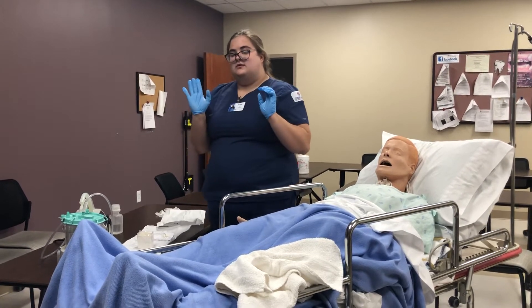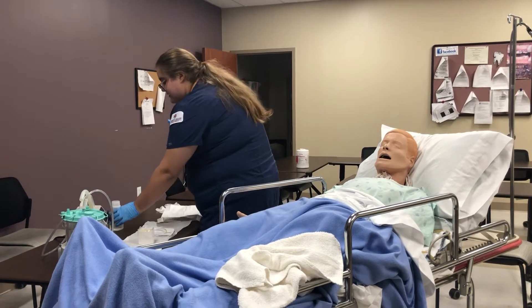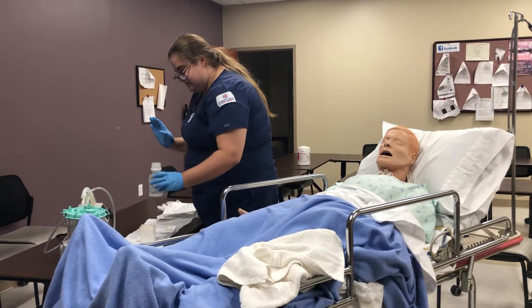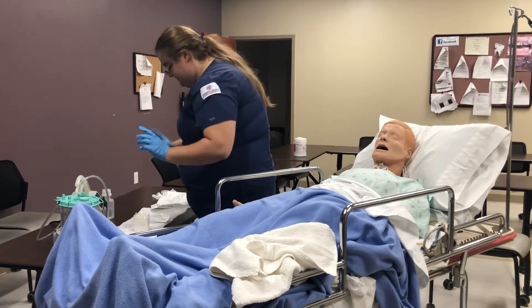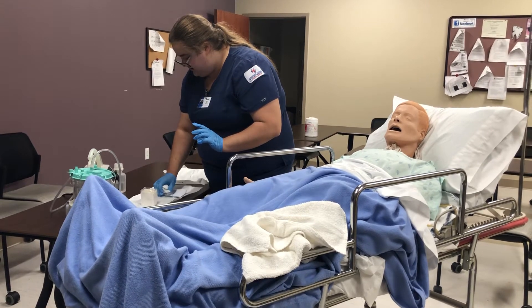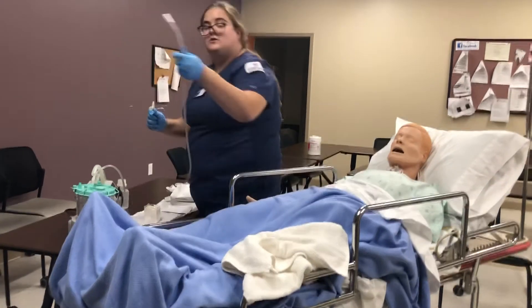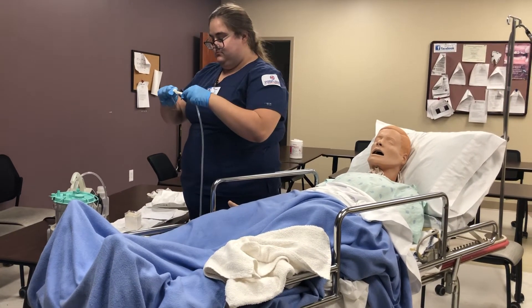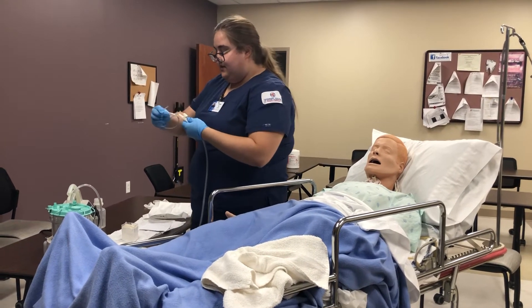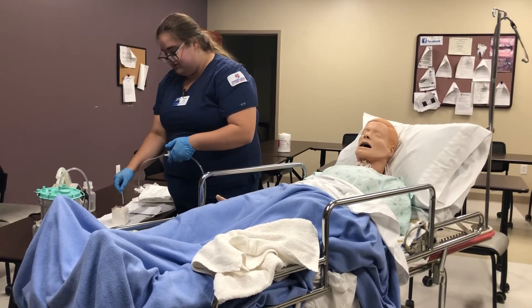From this point you will have one sterile hand and one non-sterile hand. This will be my non-sterile hand. You pour the saline into the little bucket. Then with your sterile hand you grab the catheter, and with your non-sterile hand you grab the suction. Then you will place the end of the catheter into the normal saline.